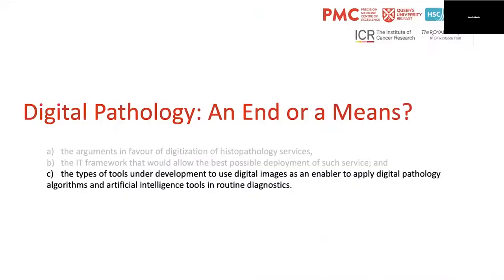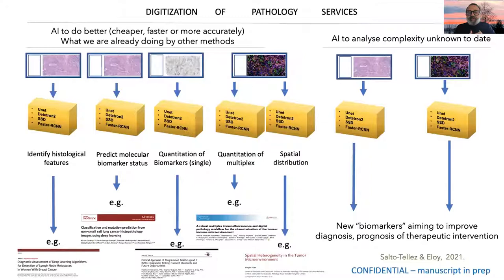The third question is, what are the tools that we have in place to do this? Again, very importantly, and this is something that I'm reviewing with Professor Eloy from Ipatimo in Portugal. There are many different tools that digitization allows us to apply as an enabler. Tools that are able to identify histological features better than pathologists, or that can predict molecular biomarker status, as you will see in the next presentation.